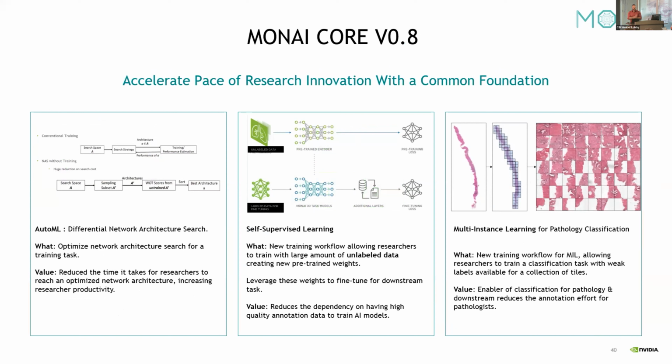So then we get into Monai Core. You saw the tutorial already on Monai Core, right? We just did that in the demo. That's where the base and chunk of everything is. That's researchy. That's your models, your downstream tasks, things like that. So we have AutoML, super important, right? AutoML is going to go in and do, I guess it's usually NAS, but they use differentiable neural architecture search that just helps you pick the best parameters for everything, right?